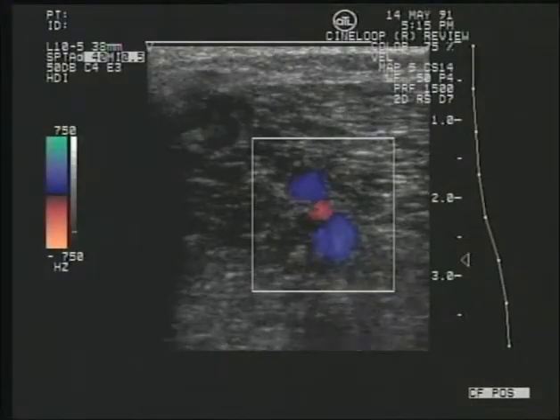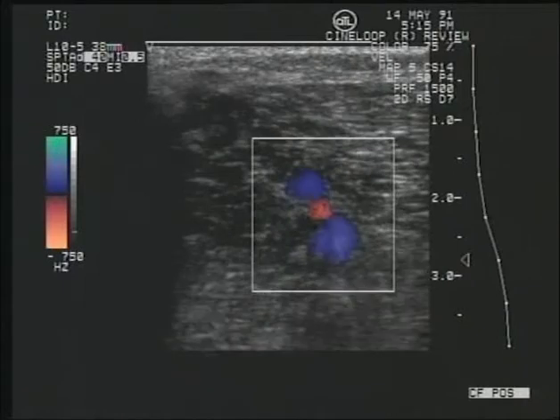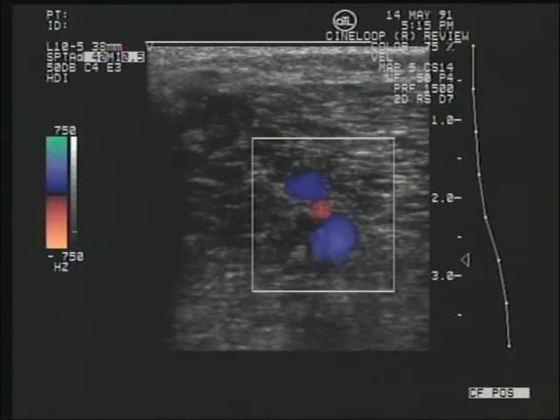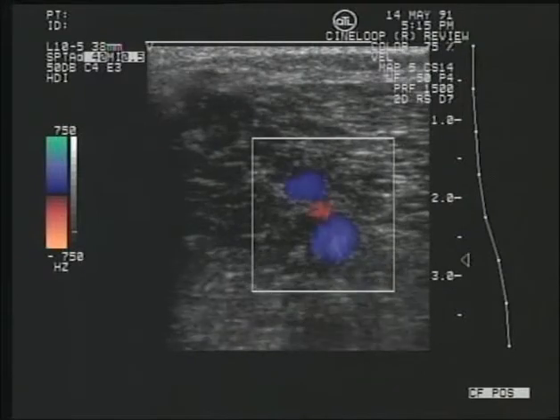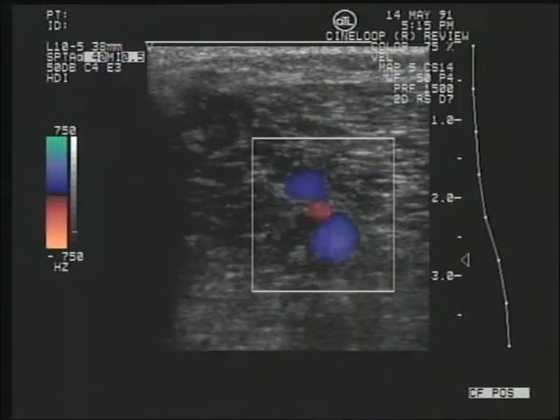We will then be ready to go through the actual examination step by step. Probe position will be shown simultaneously with what the examiner will see on the screen. Internal landmarks will be pointed out to keep the examiner oriented. After the regular grayscale examination has been demonstrated, we'll cover the additional information that can be obtained by adding color. The addition of color brings with it its own set of pitfalls, so these will also be briefly discussed.